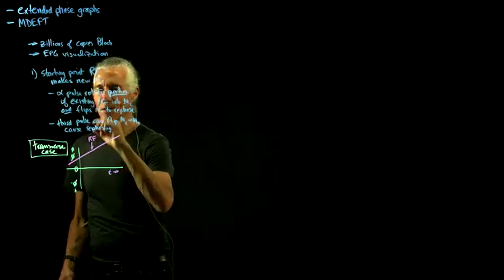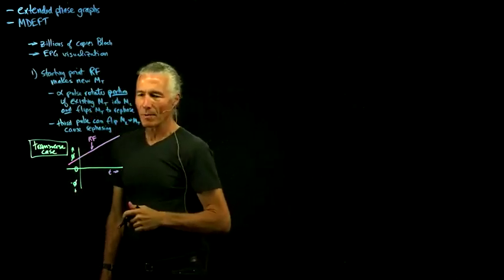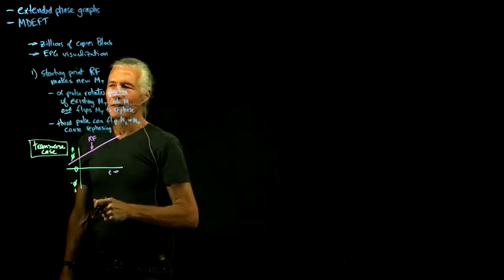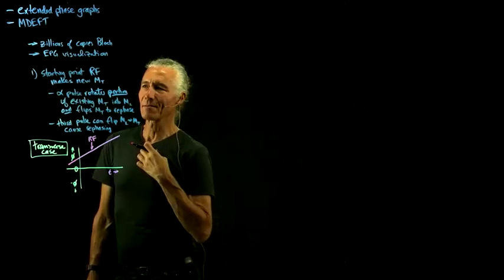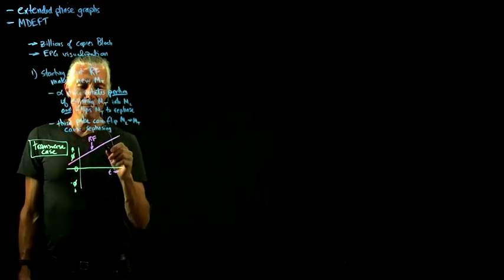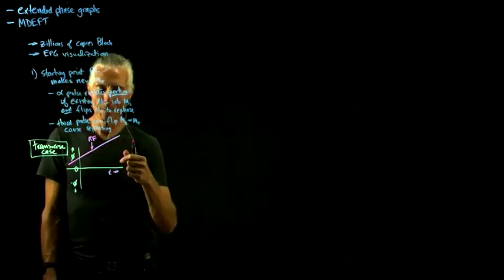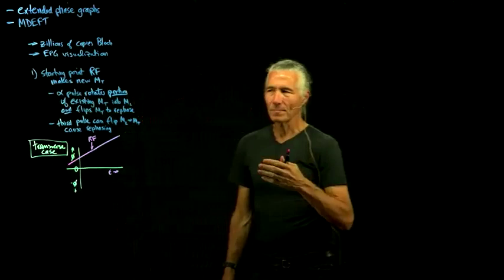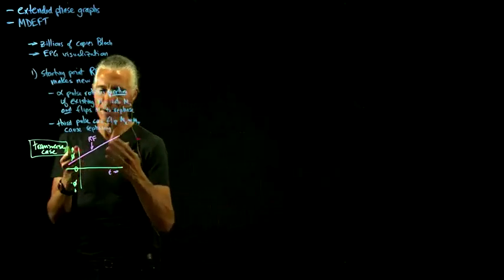And what we want to do is graph out what we just said in words. When we apply an RF, we generate 4 different pathways of phase. What are those 4 pathways? One pathway: we're not necessarily doing a 180 or 90 degree flip, it's some random 30 degree flip.